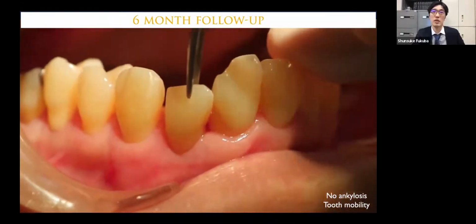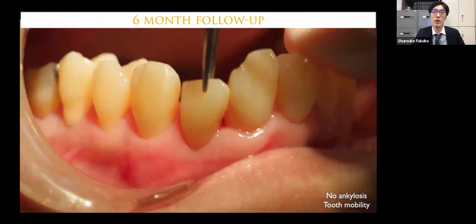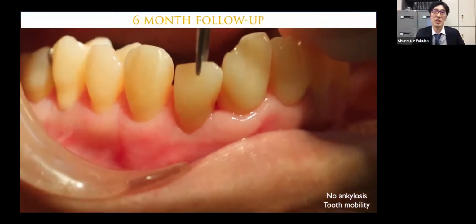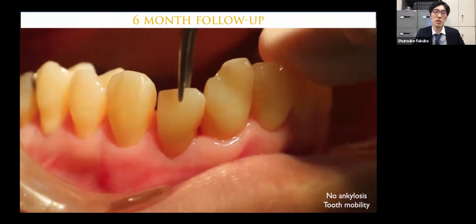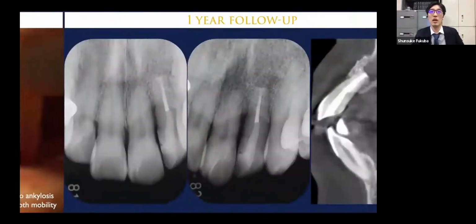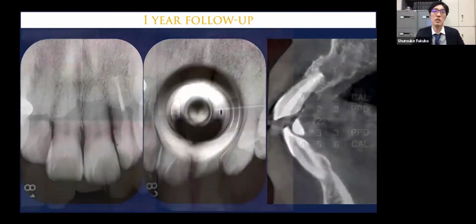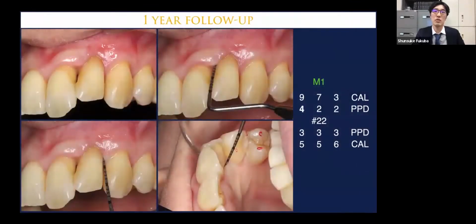After removing the resin cement fixed with the proximal teeth, 1 degree of tooth mobility was observed. It may indicate the intruded tooth was not ankylosed. At 1 year, we can see the radiographic bone fill and increased density of the lamina dura. The periodontal tissue was also stable, and the patient maintained excellent plaque control throughout the treatment. I need to closely monitor the tooth through continuous periodontal supportive therapy in the future.